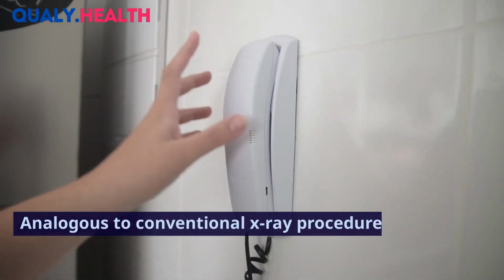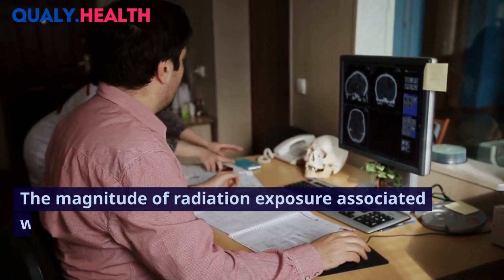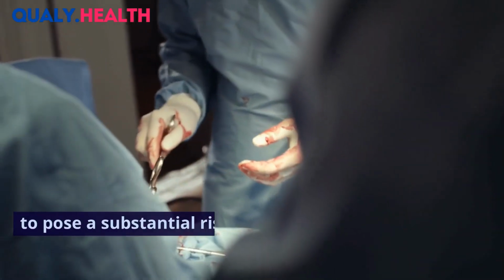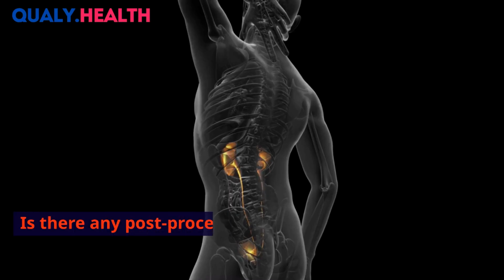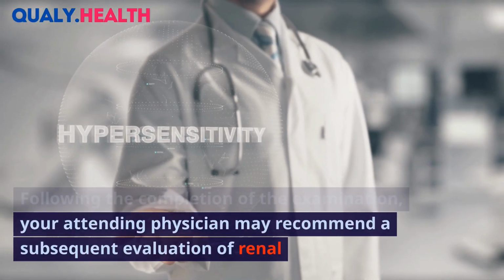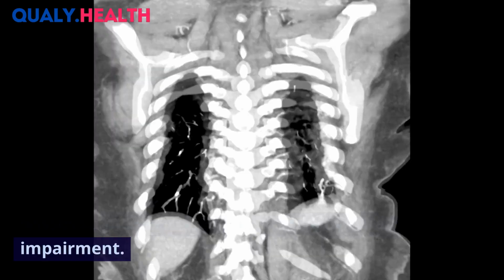Analogous to conventional X-ray procedures, CT scans entail exposure to ionizing radiation. The magnitude of radiation exposure associated with CT scans surpasses that of standard X-rays, yet it remains insufficient to pose a substantial risk, except in instances involving pregnancy. Is there any post-procedural protocol to be observed? Following the completion of the examination, your attending physician may recommend a subsequent evaluation of renal function if contrast was administered and you possess a medical history indicative of renal impairment.